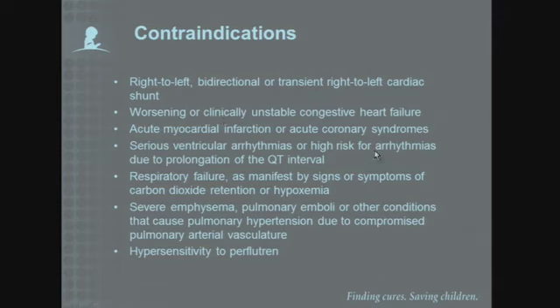Most of these are cardiac or pulmonary conditions that would preclude the patient from receiving the contrast agent. So this affected the population of patients that was primarily receiving these agents, who were cardiology patients.